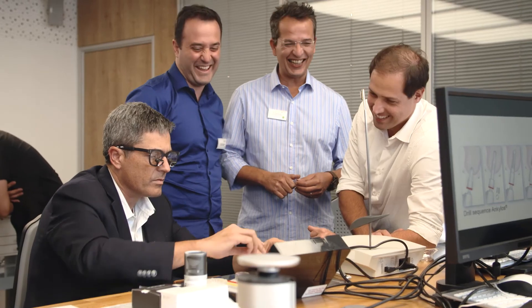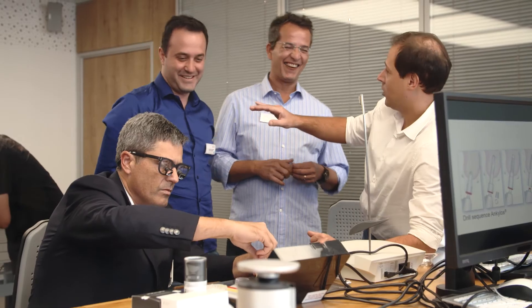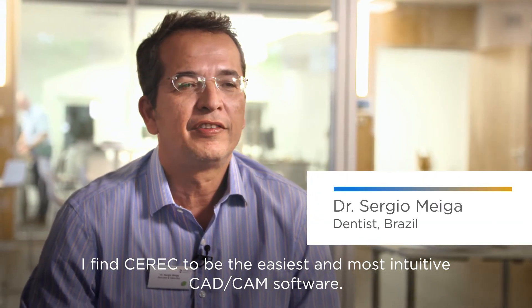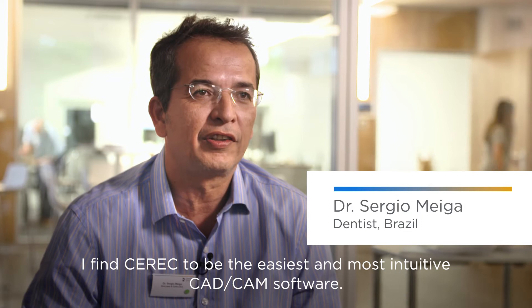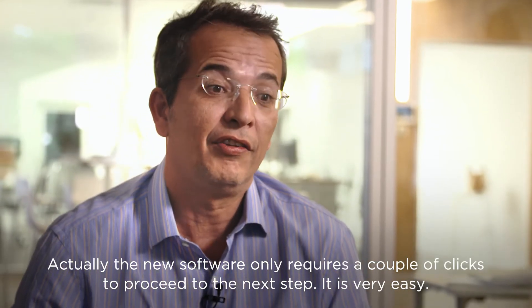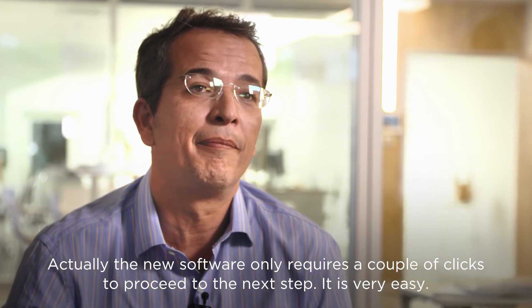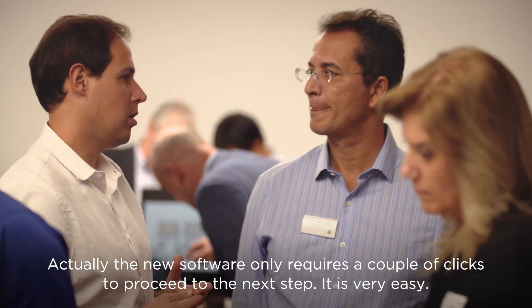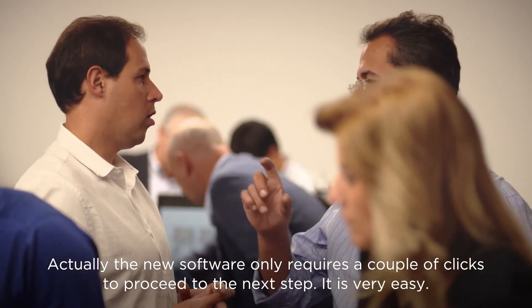It's more intuitive, it's less clicks on the mouse to make the restoration. The person doesn't have to be a nerd with computers. It's the simple way to make the restoration. I think CEREC is one of the most simple and intuitive softwares of CAD-CAM. In fact, with this new software, they are practically just clicks — you follow the next steps. It's very simple.